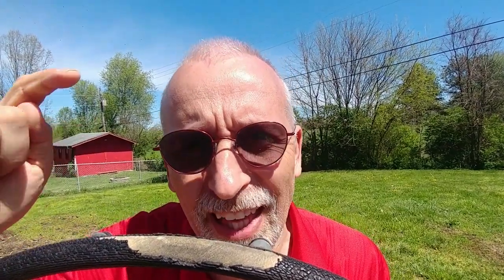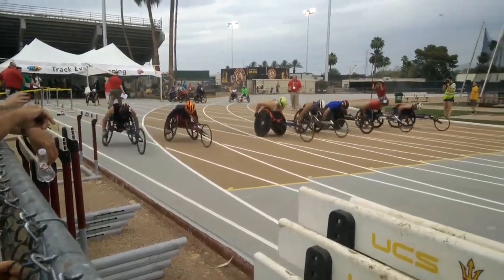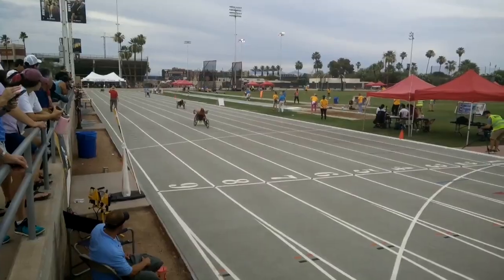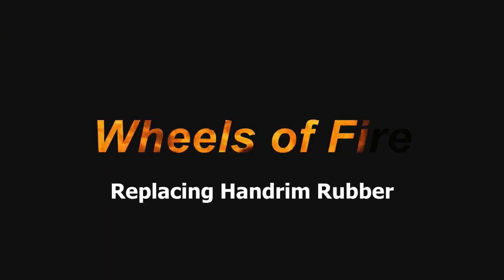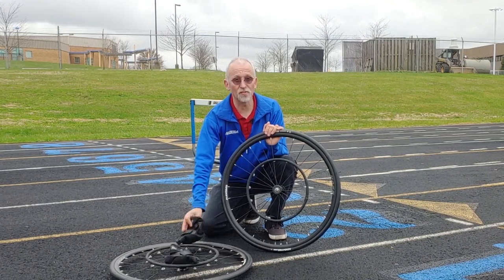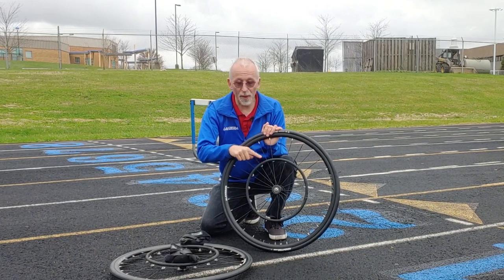Do your racing wheelchair hand rims look like this? Let's fix that. This is Raymond Jones with Wheels of Fire wheelchair racing. Wheelchair racers use special gloves and metal rings coated in rubber on the rear wheels of their racing wheelchair to propel their chair forward.